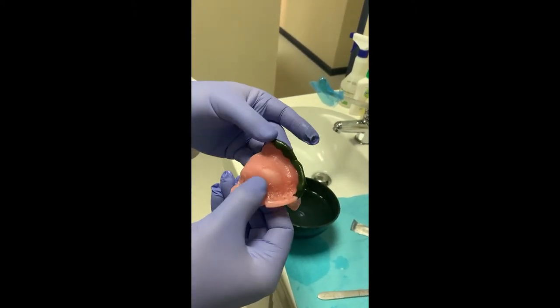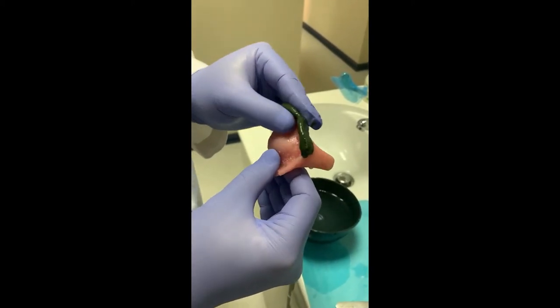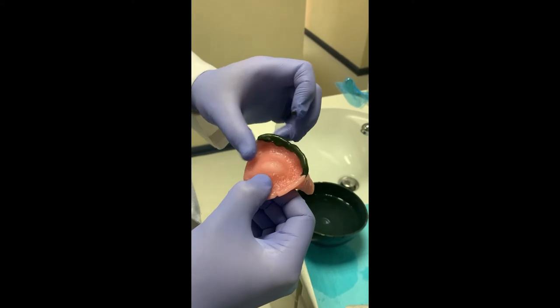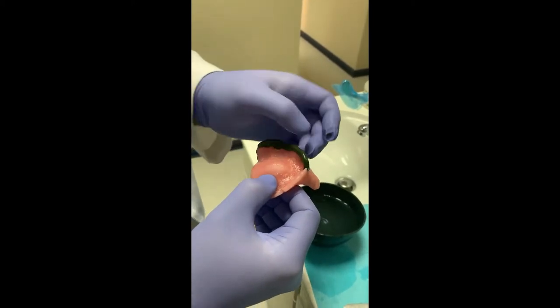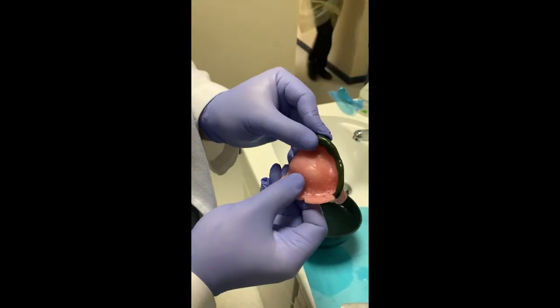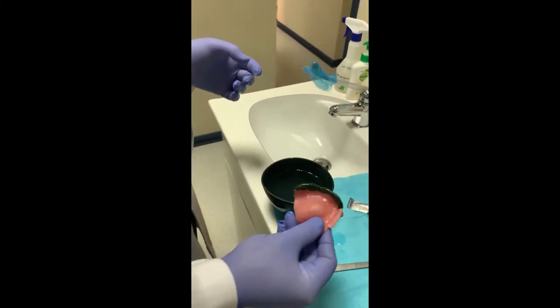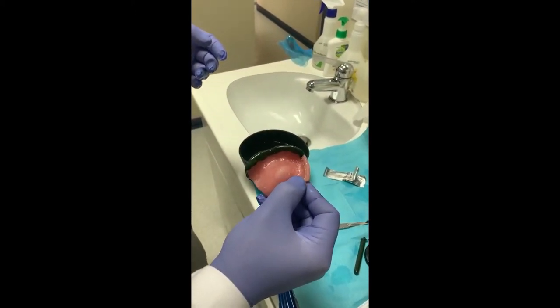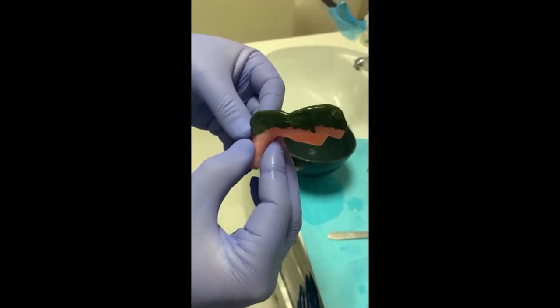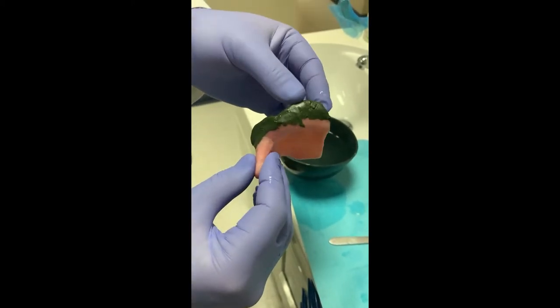Make sure that all the material is smooth and continuous, following the anatomy of the tray itself. Here we have an invagination for the buccal frenum, here for the labial frenum, and it follows the same anatomy towards the tuberosity. It is smooth and continuous, corresponding to the width of the sulcus. From outside it looks smooth — reasonably smooth.